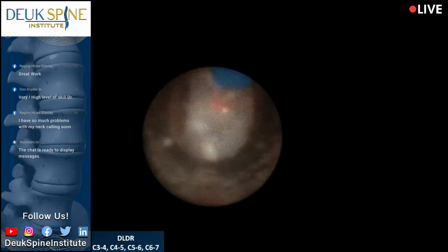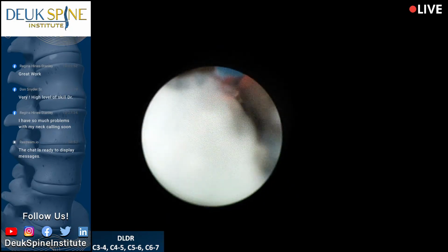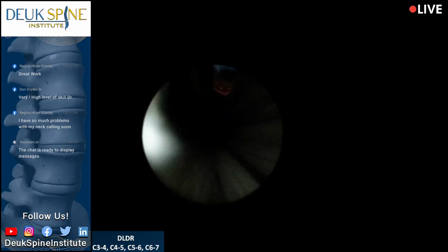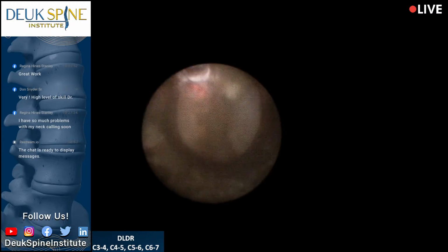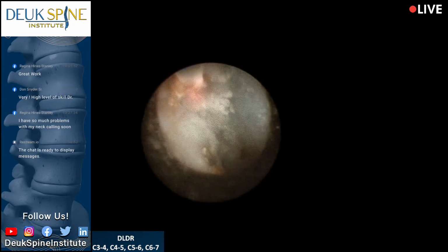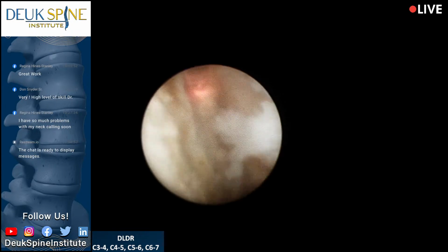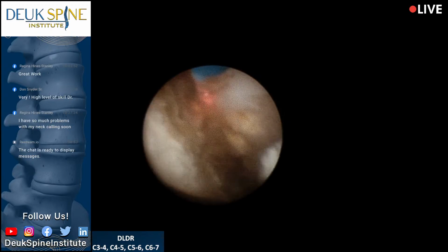Oh, look at that herniation. Just blew out of that crack down there. That's amazing. That's an old one, guys. Look at that. Smooth surfaces. It's been worked on by inflammation for years. There's another piece that's newer, still blue. The deep, deep blue staining stuff is fresher. The faint blue is older. Because remember, collagen, once a herniation gets collagenized with scar tissue, it doesn't stain. Scar tissue won't stain the blue color. So the more scar tissue, the less blue. The less scar tissue, the more blue. The older, the less blue. The younger, the more blue.